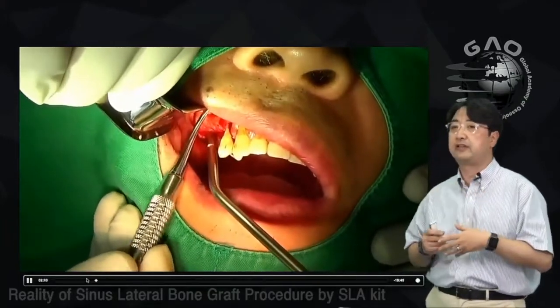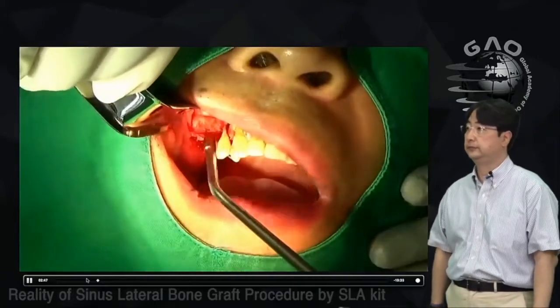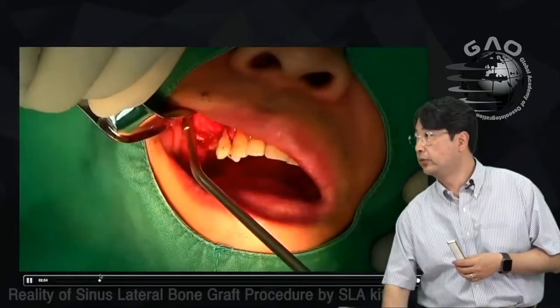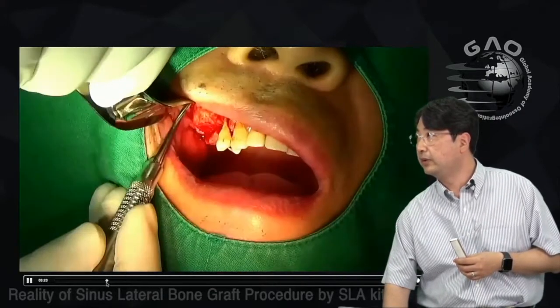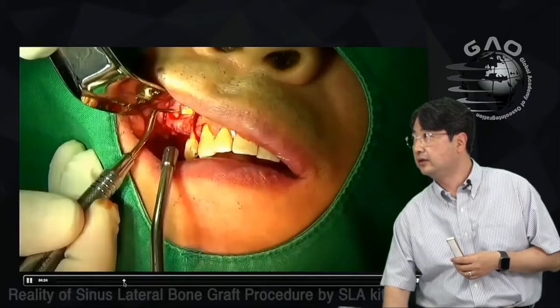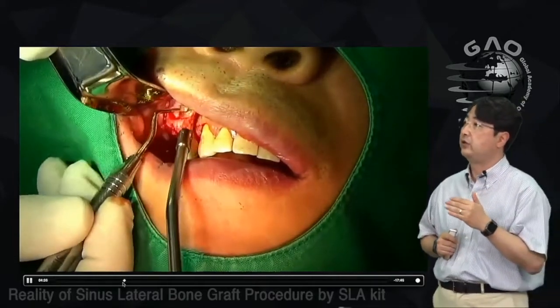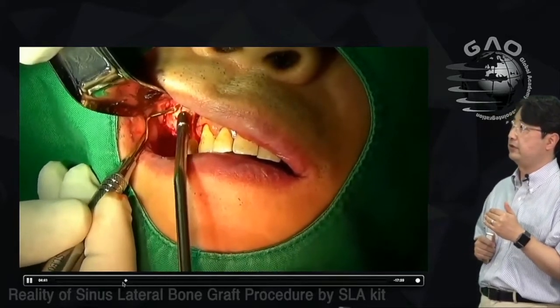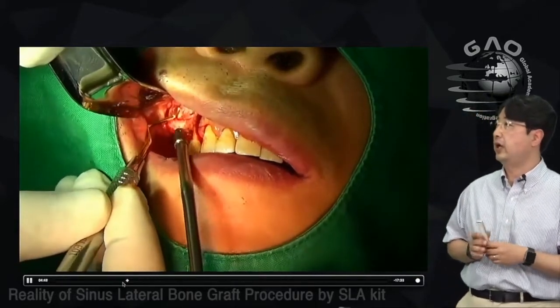This is a very careful procedure — you don't want sinus membrane tearing again. You need to allow enough time for this. Once I separate the sinus membrane, periosteum, and muscle layers, I can now see the previous window from the prior sinus graft. I proceed with freer elevator number one, two, and three in the same fashion.